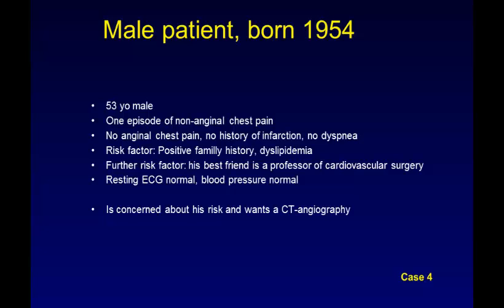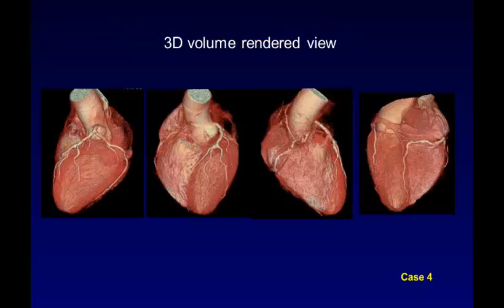You know, I like these patients if they have nothing, because I do a quick 3D reconstruction, call them and say, have a look, it's all fine. And then, oh my God, it's not all fine. There are calcifications. We need a little more time to evaluate. We will send you a report, and then the surgeon says, no, no, I want to see it right now. Tell me what you find. And that requires a little bit more evaluation, more dedicated analysis.